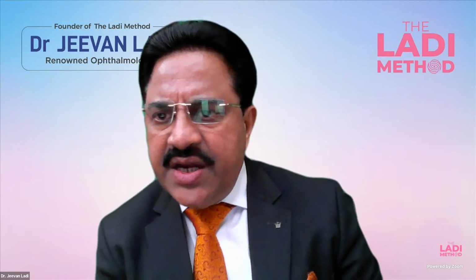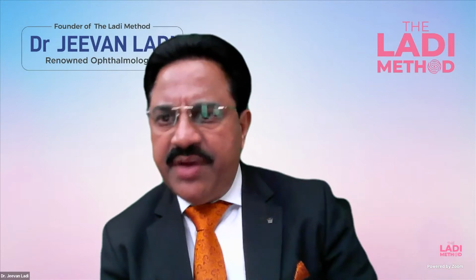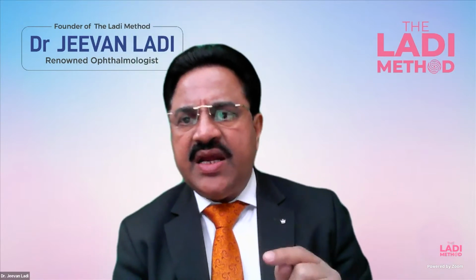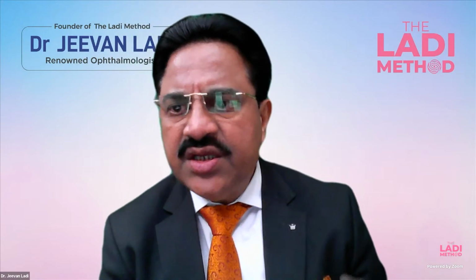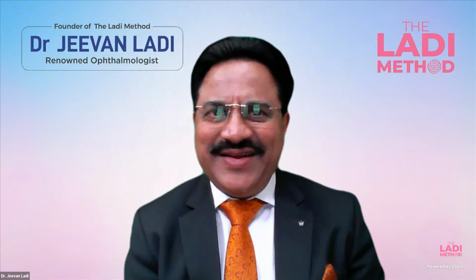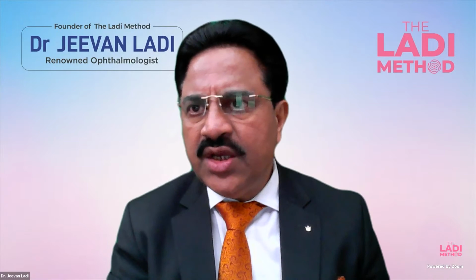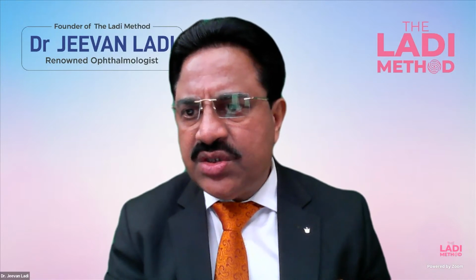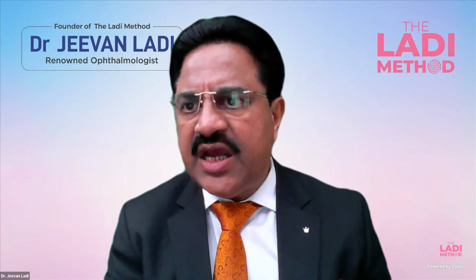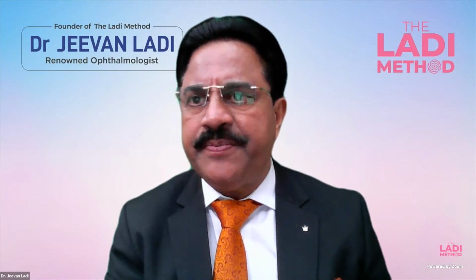By adding 200 micron, we are mimicking optical biometry. So your question is very important and very valid. Once you add 200 micron to the axial length, this is now as good as an optical reading, though not exactly. So you don't have to use the A constant printed on the lens box for ultrasound A scan.